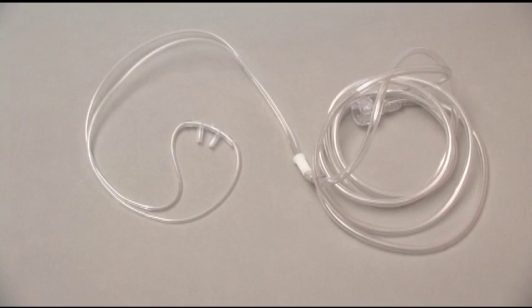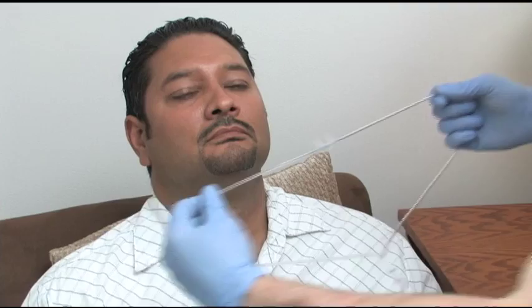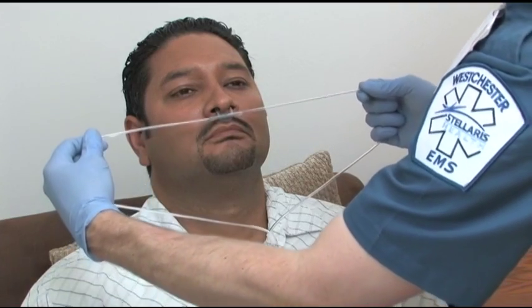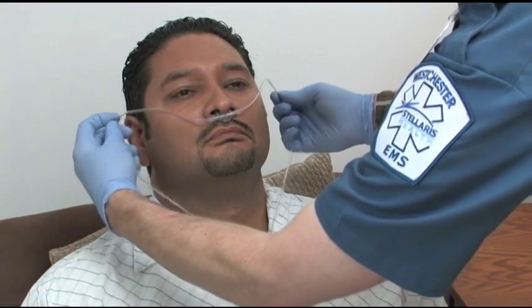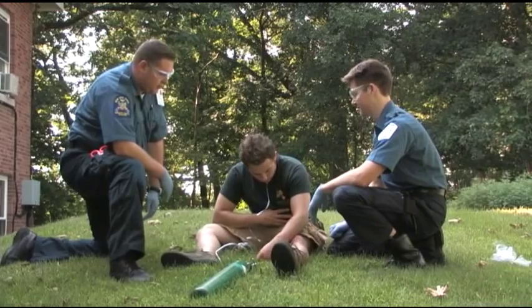A nasal cannula provides low concentrations of oxygen, ranging from 24 to 44%. A nasal cannula is indicated for patients whose oxygen saturation is between 90 and 94%, or for patients that feel suffocated by a non-rebreather mask despite your best coaching and reassurance.